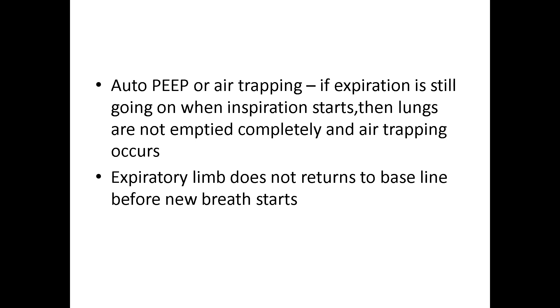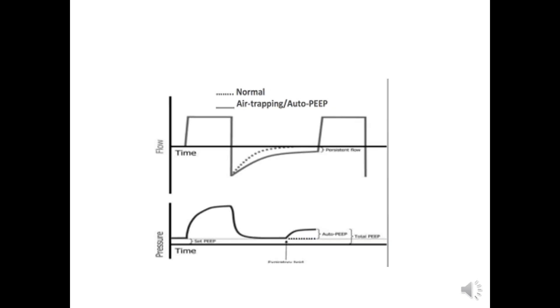Here you can see auto-PEEP depicted on a flow-time scalar. The dotted line represents the normal pattern, while the bold line depicts air trapping or auto-PEEP. In air trapping, the expiratory limb does not reach the baseline — there is a small area not returning to baseline, indicating auto-PEEP or air trapping.